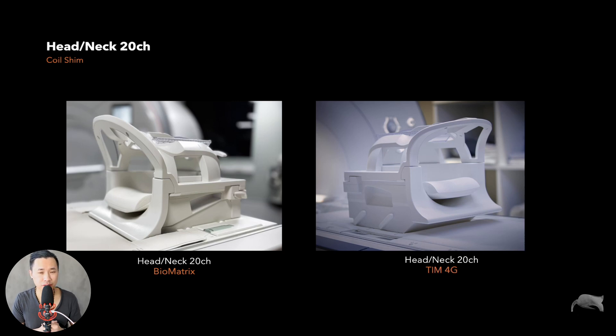As mentioned, this is the head neck 20 channel with the coil shim. You can see two different coils here — they look very similar but are built a little differently. This older one is from the Aera and Avento Fit, and this newer one is for the Lumina, Sola, Vida Fit, and Vida — the new Biomatrix systems.